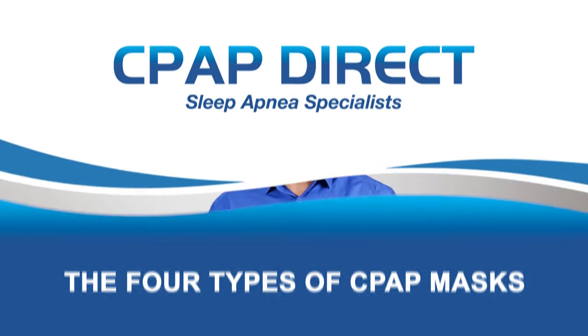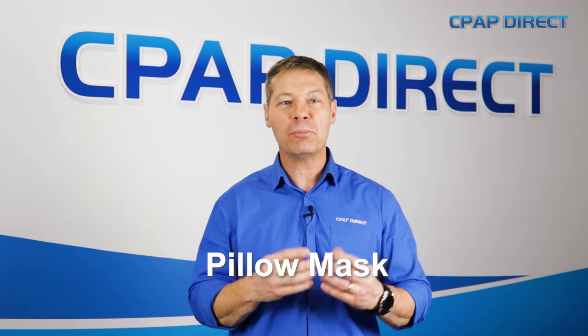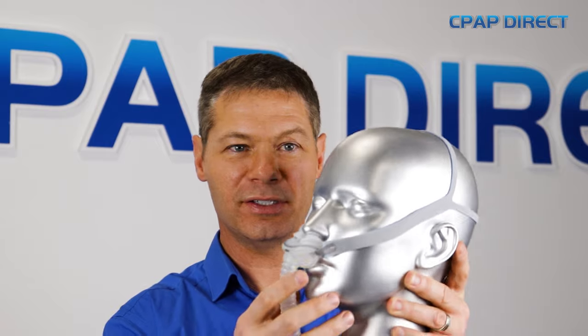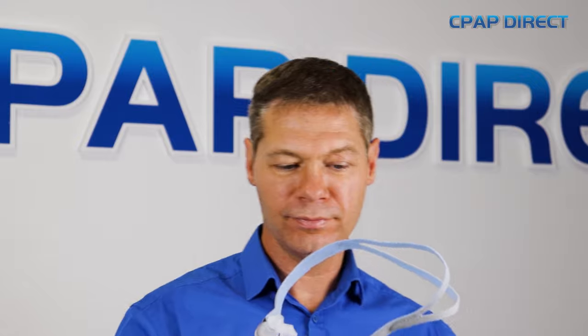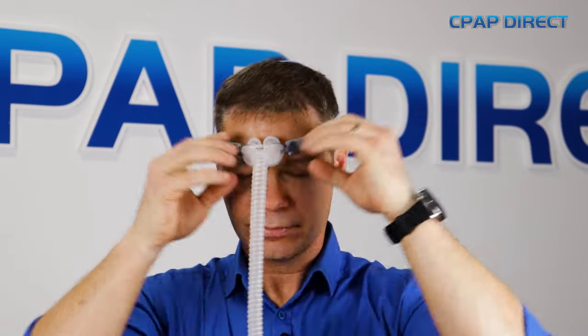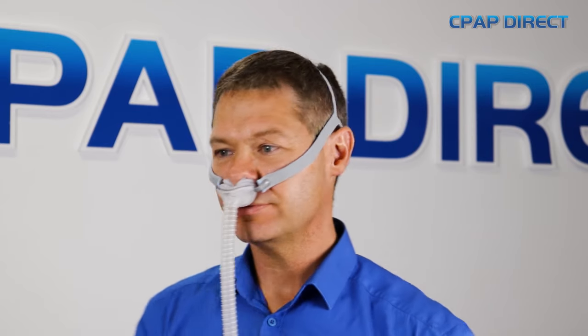The first style of nasal mask is called a pillow mask. The pillow mask has always been popular with people that have a moustache or are claustrophobic — they want something that's minimalistic on the face. They call it the pillow mask because it has little prongs that sit just inside the nostrils and shoot air straight into the nose to inflate the throat. They're minimalistic on the face and very popular.